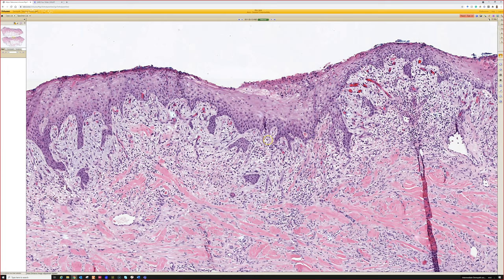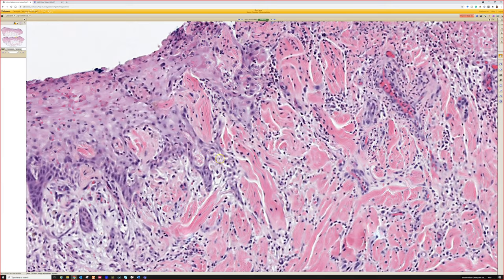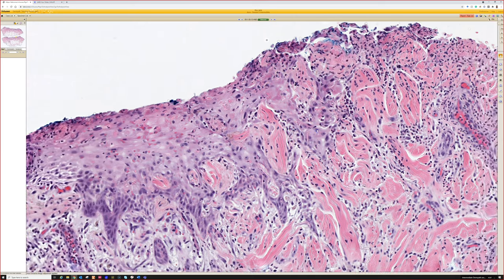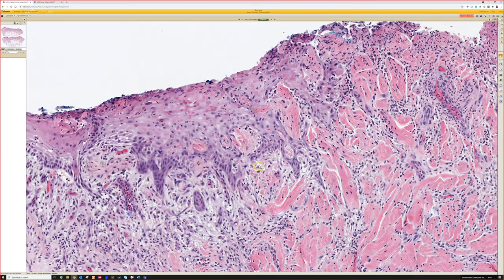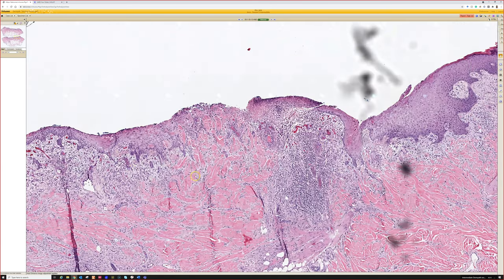This kind of jagged edges of the rete pushing down into the granulation tissue in the dermis, I find that really helpful for reactive. See how jagged and kind of distorted this gets? And look, you can even see here, it's out of focus, but it actually helps us because we can see the fibers. Look at the elastic fibers. In reactive pseudoepitheliomatous hyperplasia, the epidermis loves to kind of grab and wrap around elastic fibers in the dermis. Keratoacanthomas do that also, by the way, but obviously this doesn't at all look like keratoacanthoma architecturally. So good example of reactive epidermal changes and squamous syringometaplasia at a biopsy site. Don't mistake it for cancer.